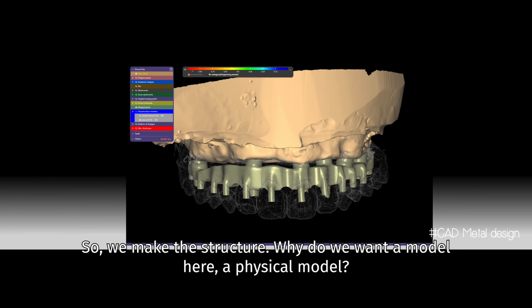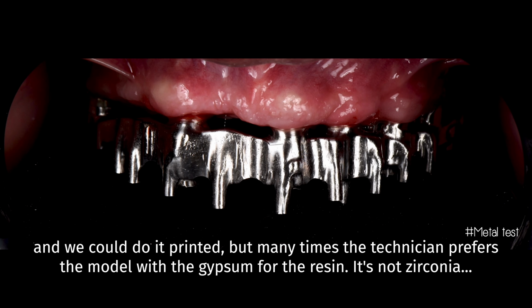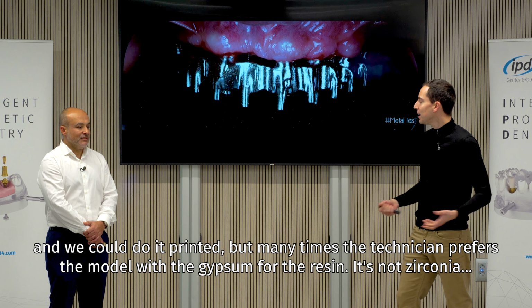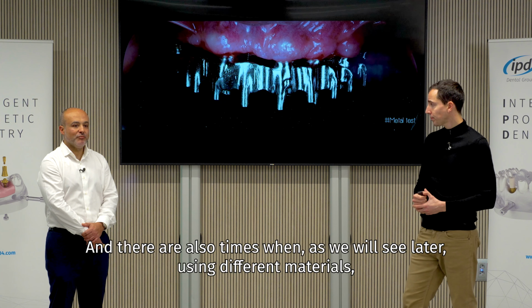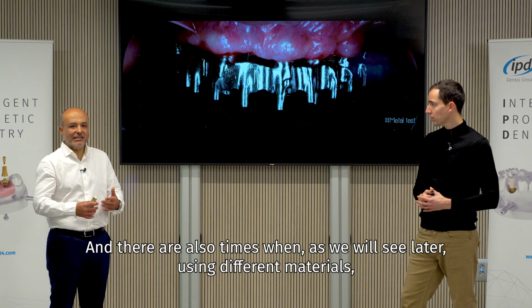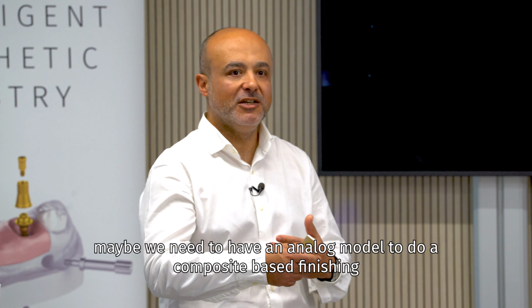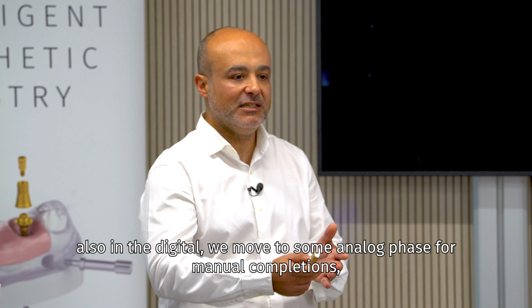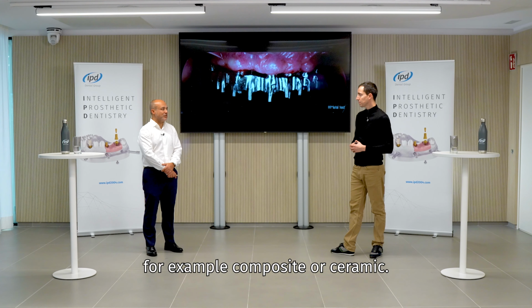Why do we want a model here, a physical model? Because in this case, we are going to do a restoration, a hybrid, and we could do it printed, but many times the technician prefers the model with the gypsum for the resin. It's not zirconia. And there are also times when, as we will see later, using different materials, maybe we need to have an analog model to do a composite-based finishing, or to have axis tracking with the antagonist. And even though we can have it also in the digital, we move to some analog phase for manual completions, for example, composite or ceramic.